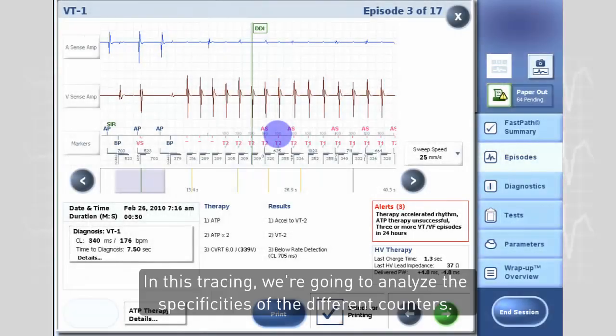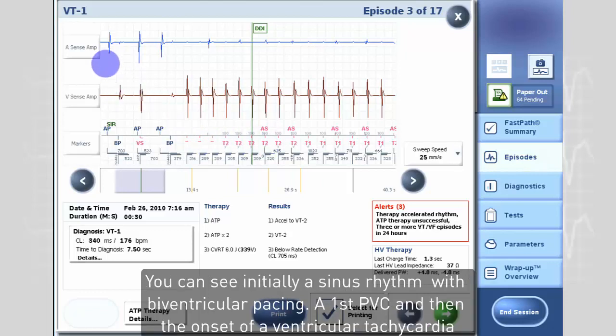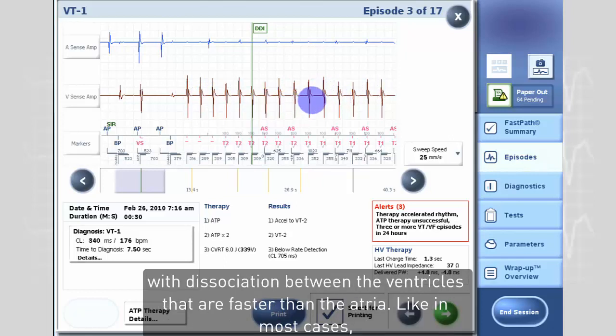In this tracing we are going to analyze the specificities of the different counters. You can see initially a sinus rhythm with biventricular pacing, a first PVC and then the onset of a ventricular tachycardia with dissociation between the ventricles that are faster than the atria.